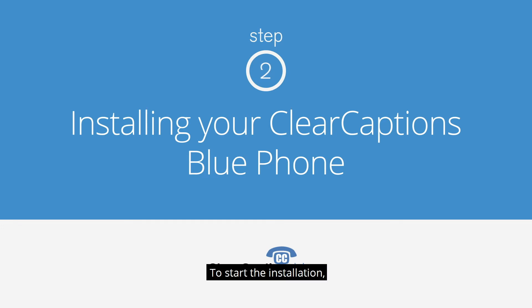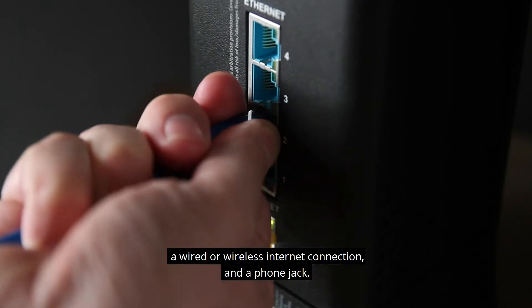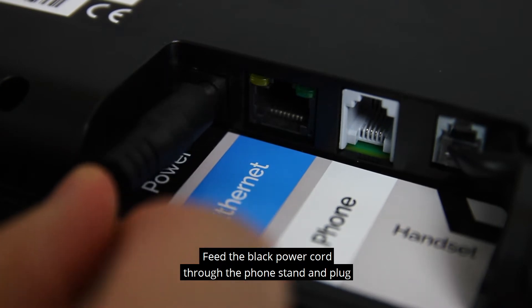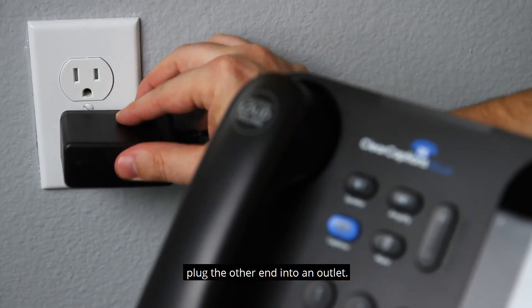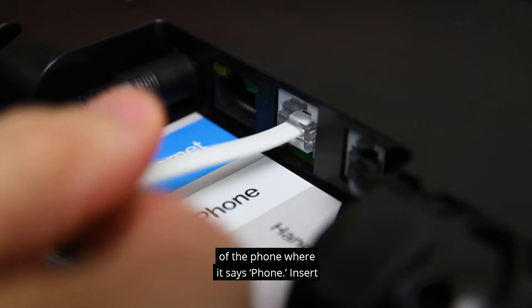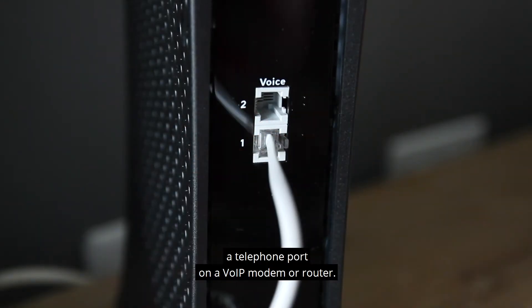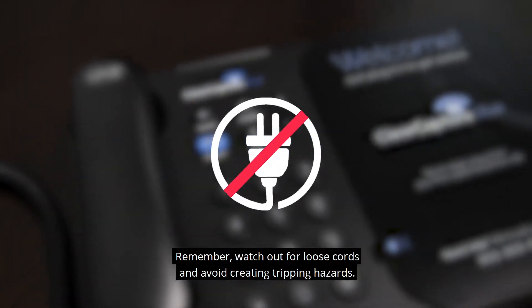To start the installation, place your new Clear Captions Blue phone near a power outlet, a wired or wireless internet connection, and a phone jack. Feed the black power cord through the phone stand and plug it into the back of the phone where it says Power, then plug the other end into an outlet. Plug the white phone cord into the back of the phone where it says Phone, and insert the other end into a wall jack or into a telephone port on a VoIP modem or router. Remember to watch out for loose cords and avoid creating tripping hazards.